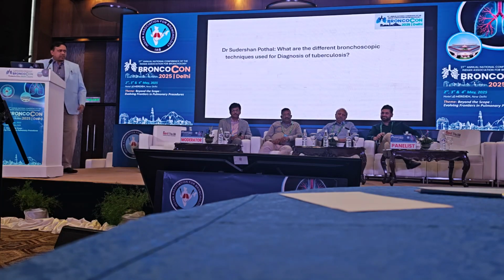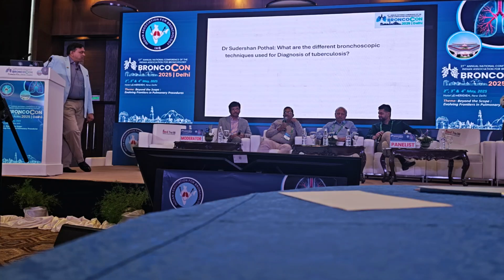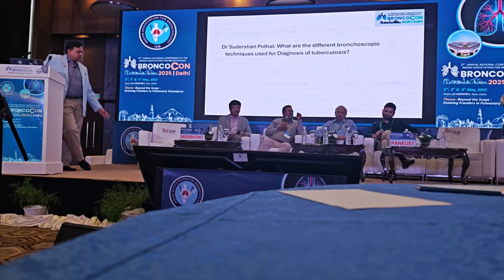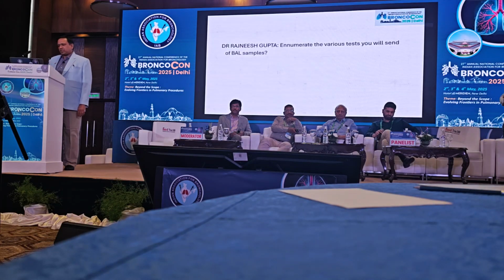Definitely. Yeah, Kamlesh. So next question to Dr. Sudershan. What are the different bronchoscopic techniques used for diagnosis? Yes, classically what we used to do are bronchoalveolar lavage, bronchial washings, brushings, and even radial probe biopsy. Very good. TB and classical, both the things, conventional and advanced.